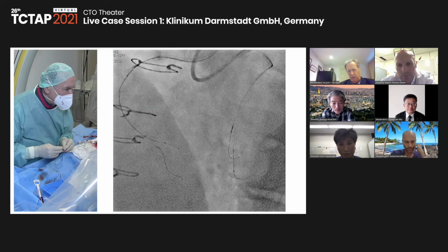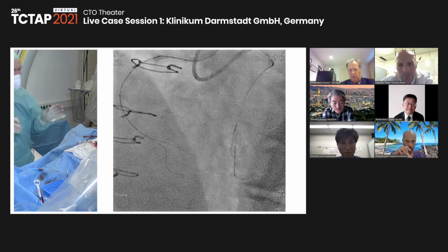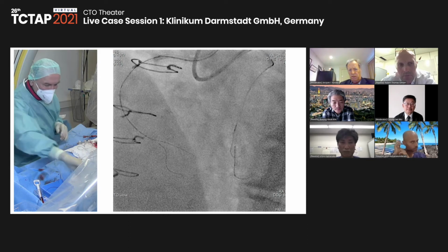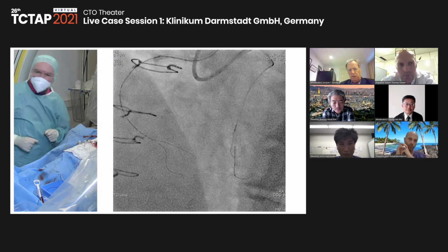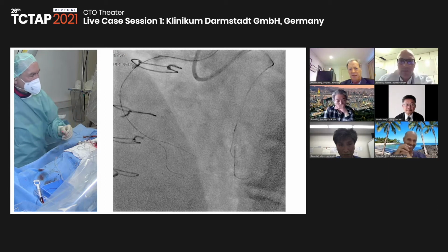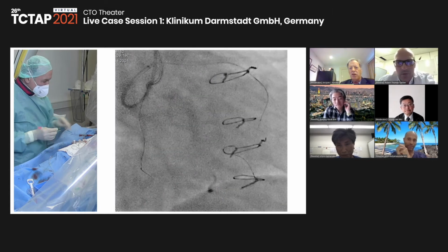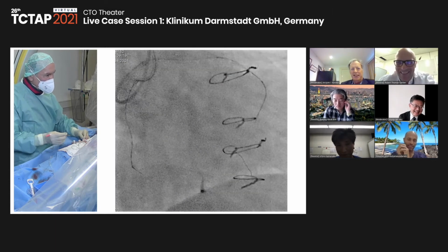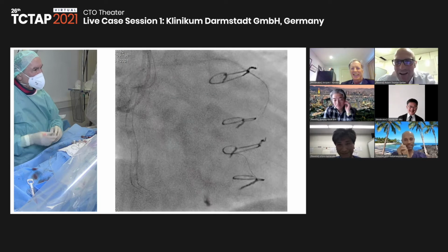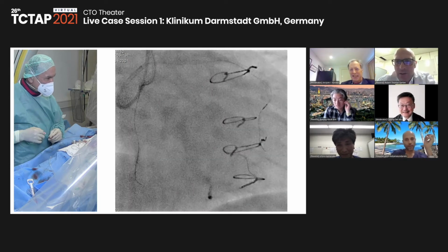So as I have not given up on the retrograde option, that is better than before. And if we prevent my colleague, he has to hit my arms when I ever touch this wire again. It's always the colleague's fault. No, it is not. I know the feeling. Or the fellow. You have to blame the fellow, even if they're not in the hospital.